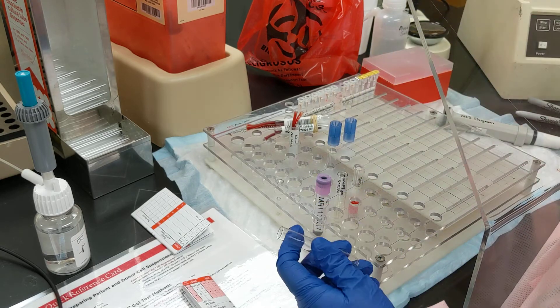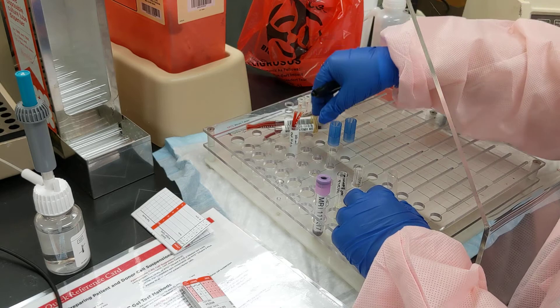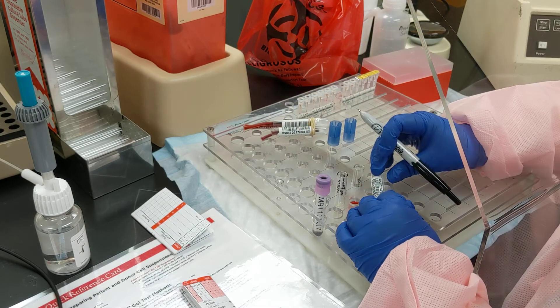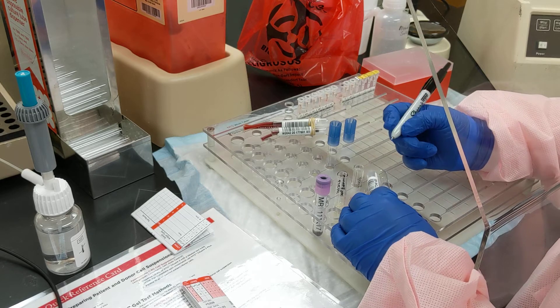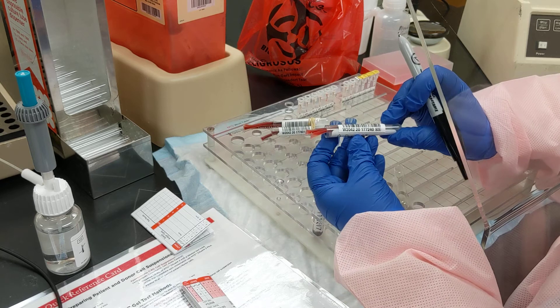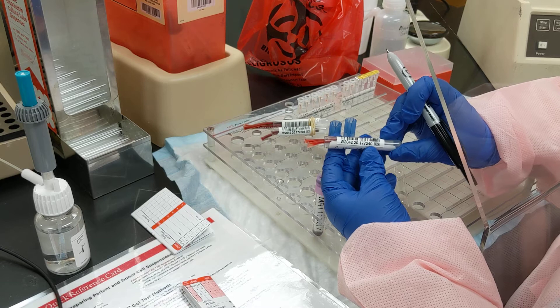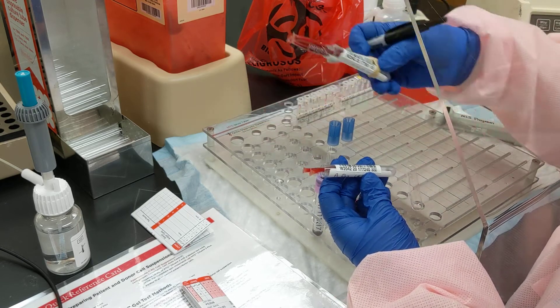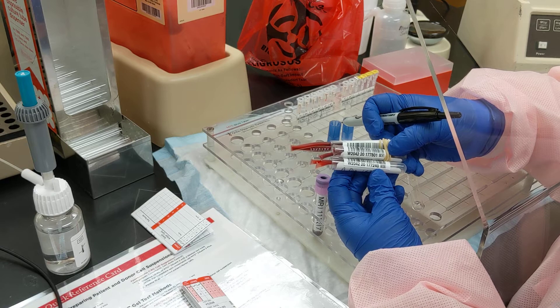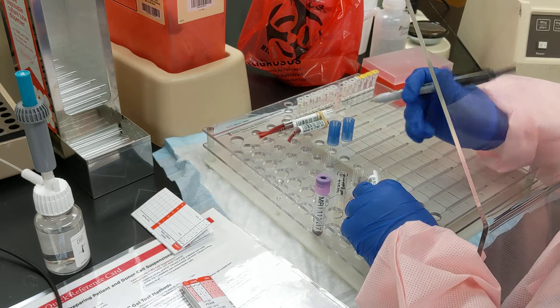What you need to do is label the tube with the unit number that you're going to put in it. Depending on where you work, there are different ways they want this abbreviated. The best way is to use either the last three or four numbers of the unit number, unless they're similar — in that case, you need to keep going until you get a unique number. Use more digits out of it.